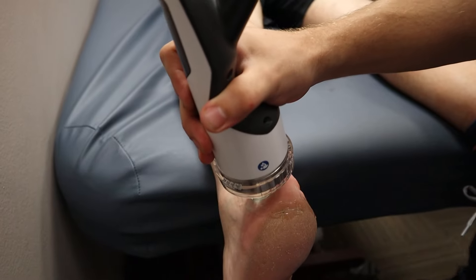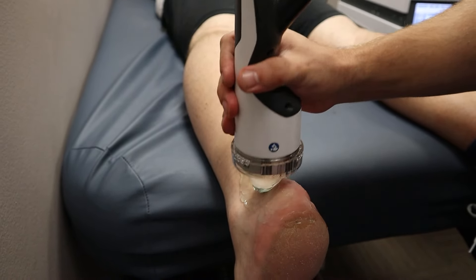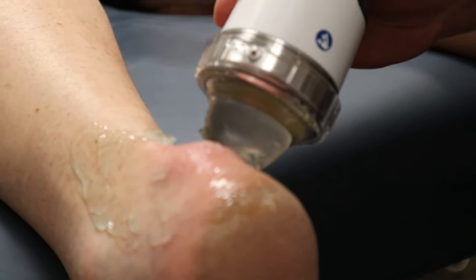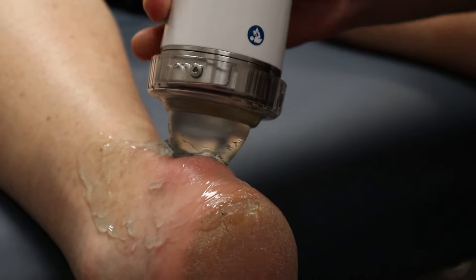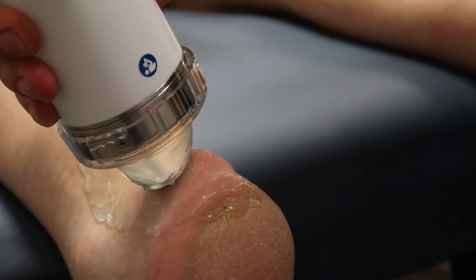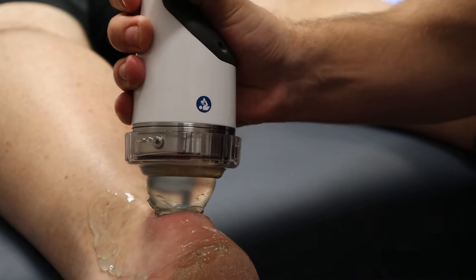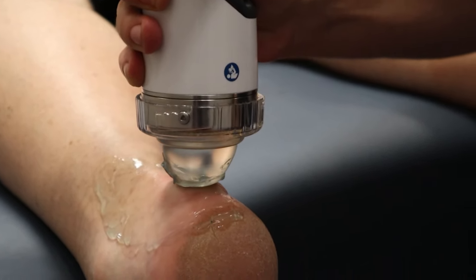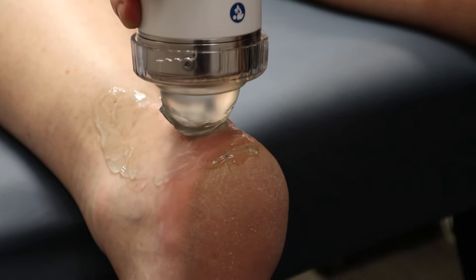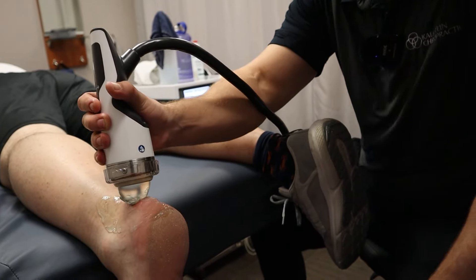So we're really just going to spend all of our time attacking the problem right here, which is this little bit of inflammation and swelling on the Achilles heel. That's where we're going to send the majority of our energy today. We might dip into the heel just a little bit to see if we can find anything on that kinetic chain, but for the most part we'll stay right here. This focused shockwave is really easy to think of as almost like a sniper rifle blast — you want it right direct on the problem area, whereas the radial pulse uses more of a broad-spectrum, painting-the-picture technique.